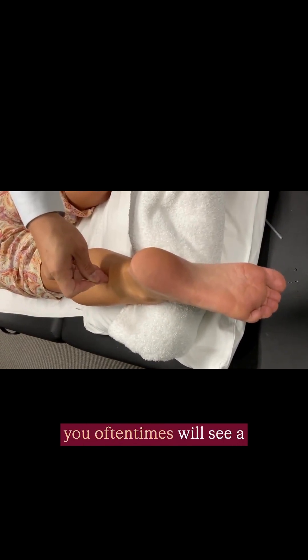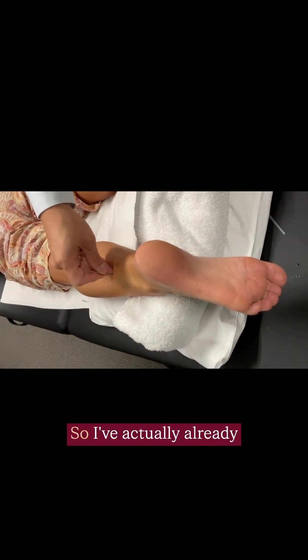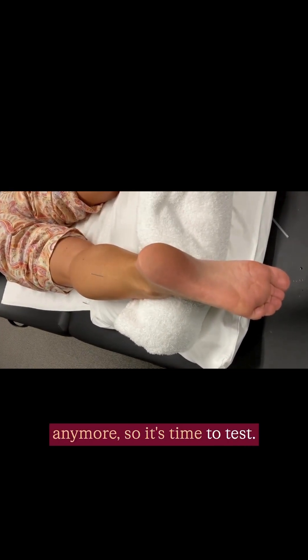As you're doing this, you oftentimes will see a flinch of the muscle. I've actually already touched bone and can't go further anymore, so it's time to test.